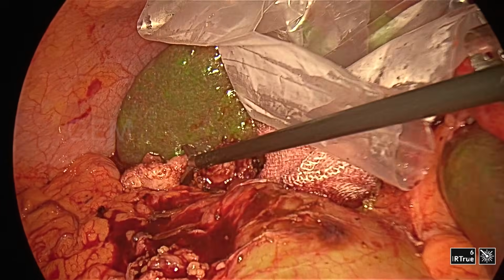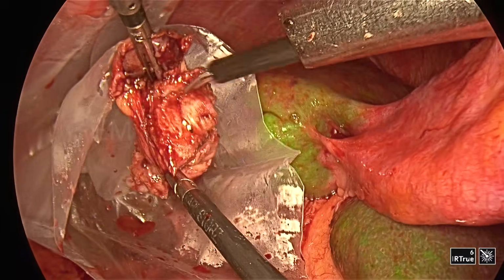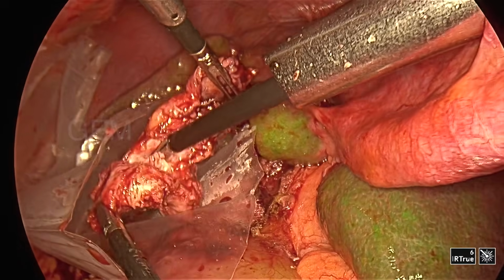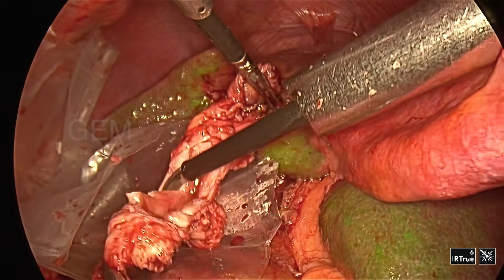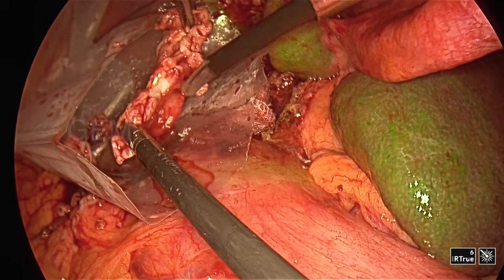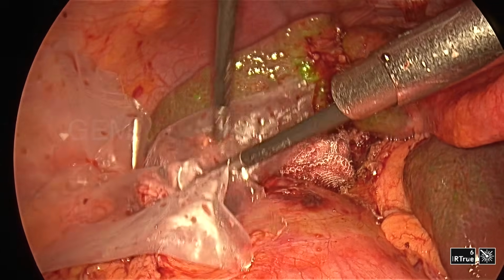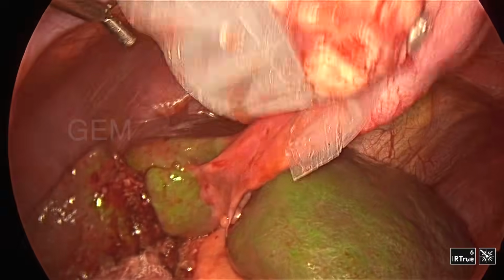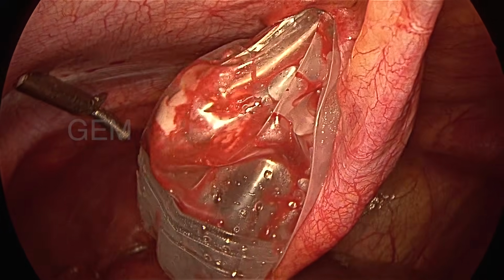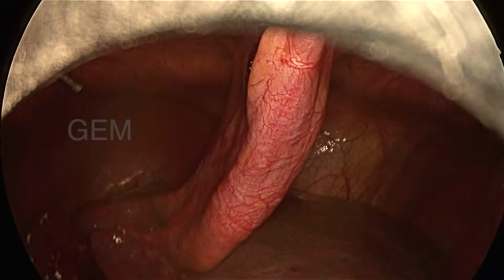So the excised gallbladder is placed into the endo bag, and it is a thick wall. So I am trimming it, otherwise it will not come through the 10 mm port. Cut it into 2-3 pieces, and then take it out through the 10 mm port without enlarging the port. I take it out in pieces with the bag, plastic bag protection, so the port site does not get infected.